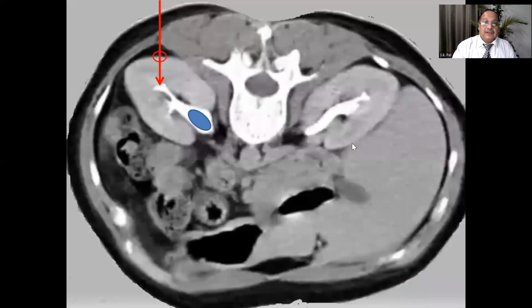So we have three types of access into the pelvic calyceal system. This is 0 degree bullseye. You are entering through this portion of the renal parenchyma. This is 30 degree bullseye, a little more lateral. You are making an entry into the renal pelvis, and maybe you are in alignment with the infundibulum. And lastly, gradual descent technique.